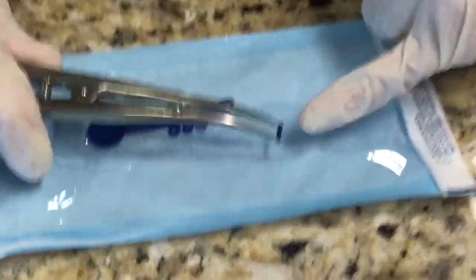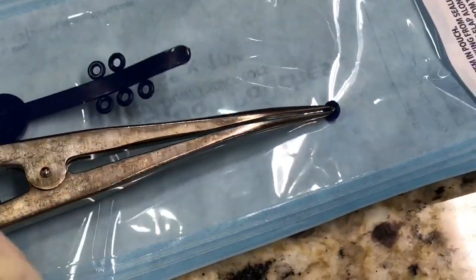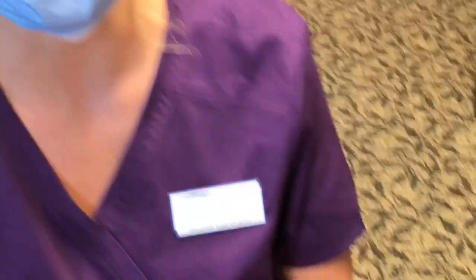So these are like little rubber bands — they're called spacers and they go between the molars on the top. Over a week's time they're going to create a space so that when you come back, we'll have a space and can actually fit a band. Right now a band won't fit because the teeth are together, so it'll make a little tiny space. We'll slip it on there and then we can make the expander.